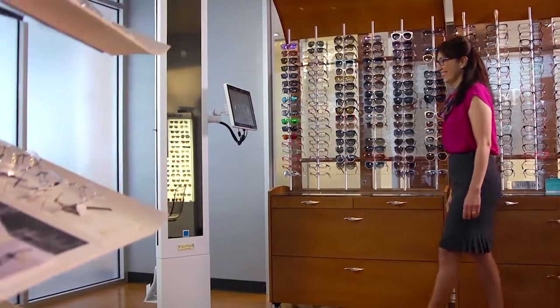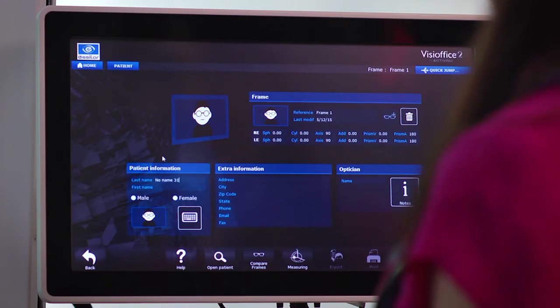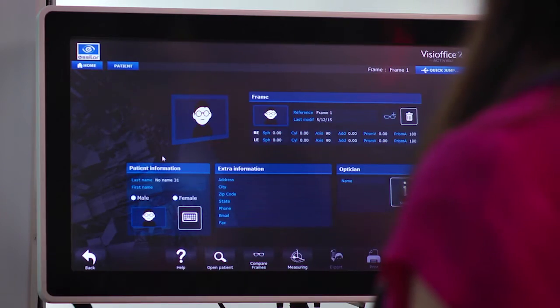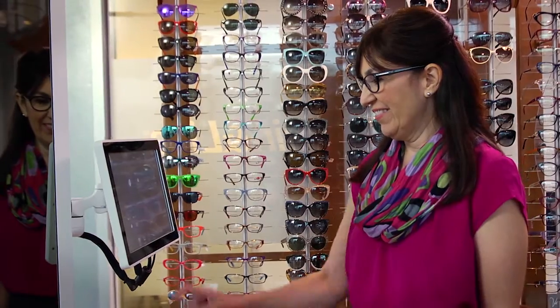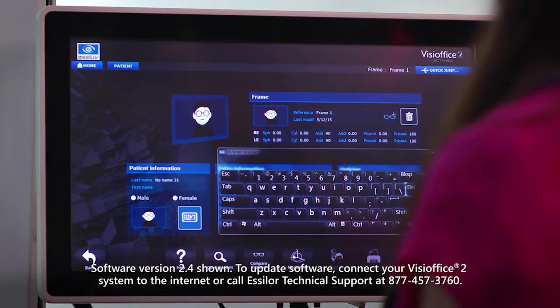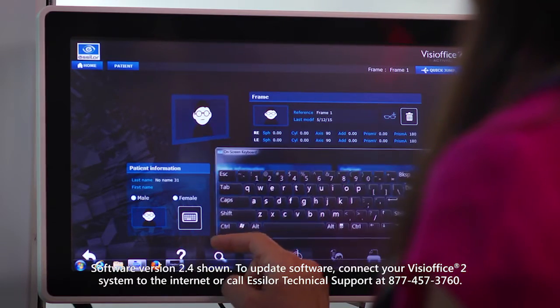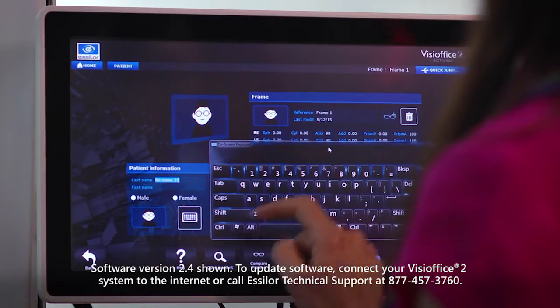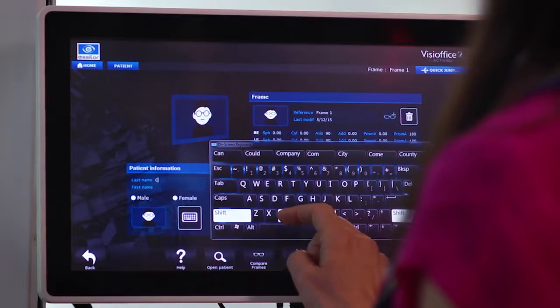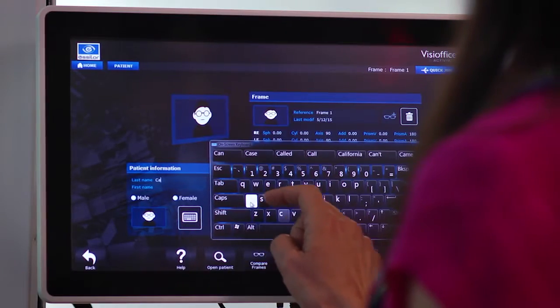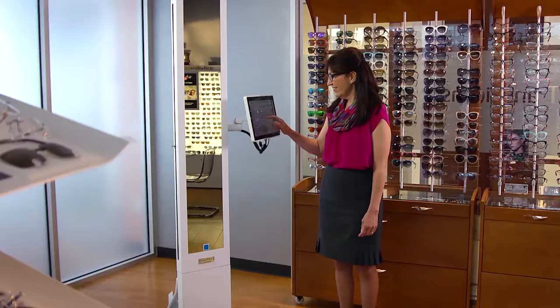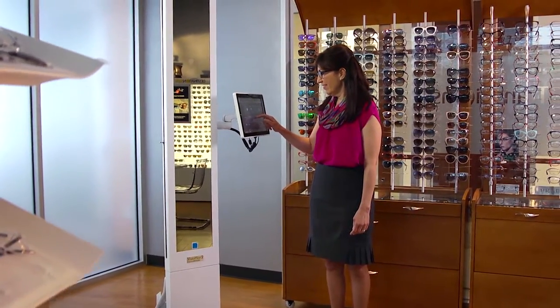To create a patient record, first select the patient icon on the home screen of your VisiOffice 2 system. Select the keyboard icon and resize it by dragging the corners if necessary. To move the keyboard, touch the top and drag. Enter your patient's last and first names under the patient information section, then the frame model number in the frame section.